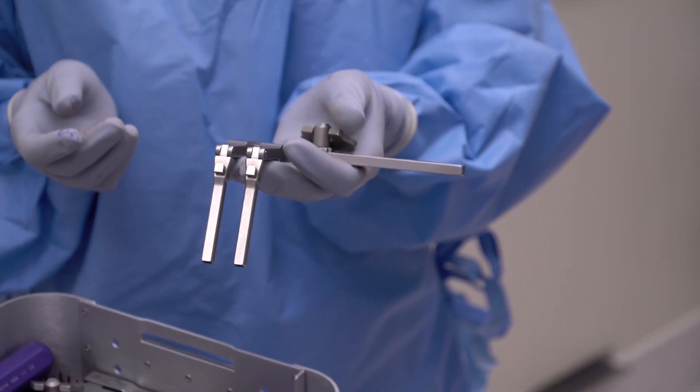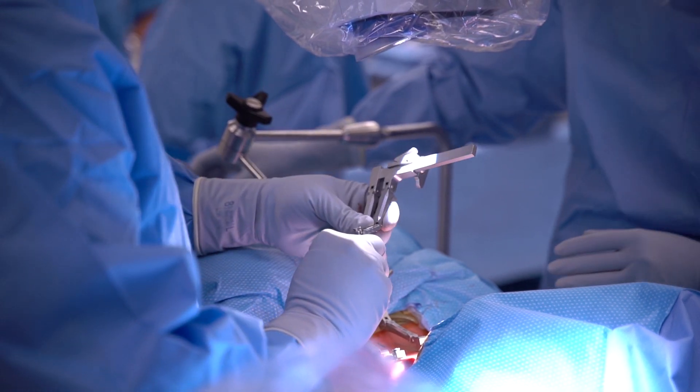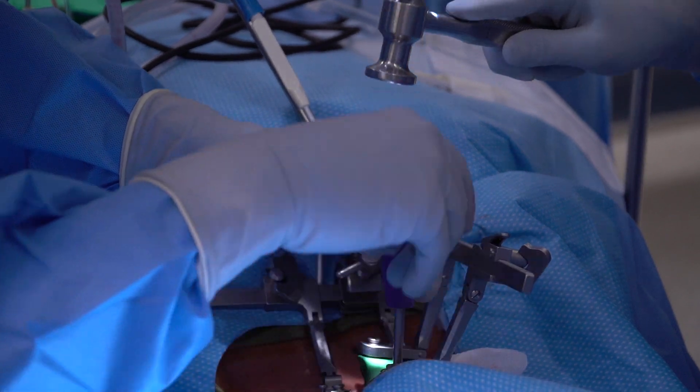The locking mechanism is nice so that the actual distraction pins lock into the distraction. When the distractor is opened, it allows you to maintain that position and the distraction mechanism doesn't ride up on the pins themselves. There are two different sizes — a smaller and a longer variety — also for smaller patients that hold in place, and anytime you're impacting, the distractor doesn't ride up off the pins either.